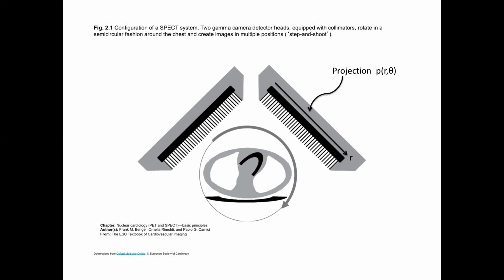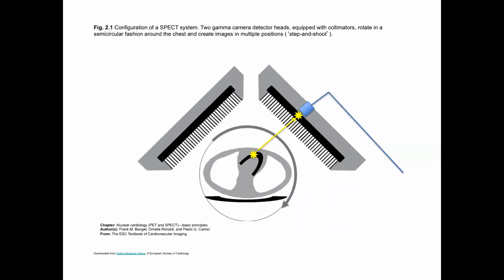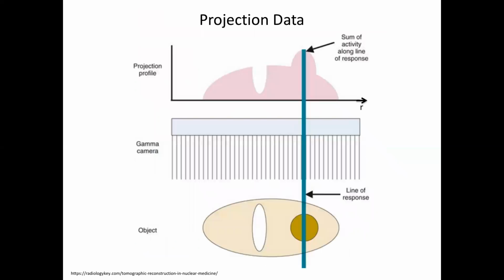Okay, so now we're going to look at the data itself and how you make, in the nuclear medicine lecture, we talked about, do I have a picture back here now? This came up in the lecture itself, where here's our object or our patient where we have no agent in this part, got some kind of baseline amount here and then a hot spot here.